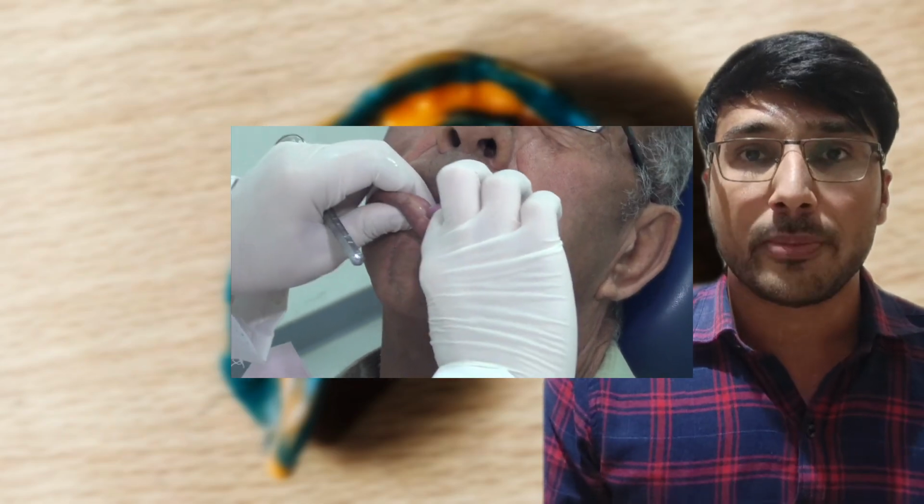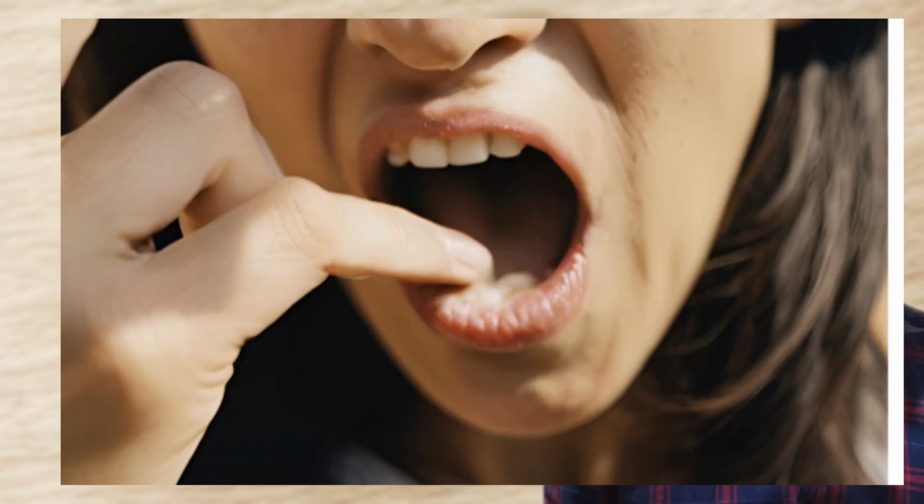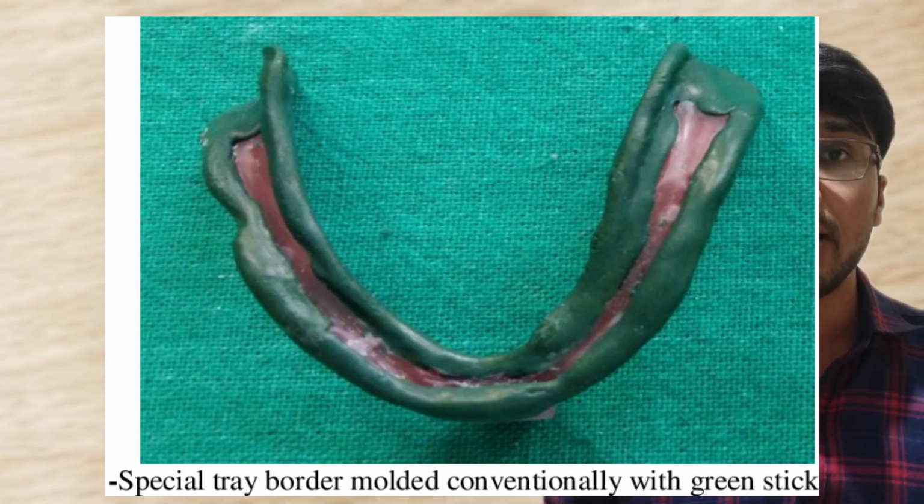For the retromolar pad area, the tray should cover half of the retromolar pad and it should not extend beyond the pad. Ask the patient to close the mouth with your finger resisting the movement. This will record the pterygomandibular raphe. Your border molding is done. Clean the tray, dry it.